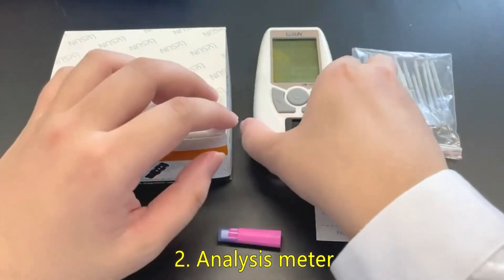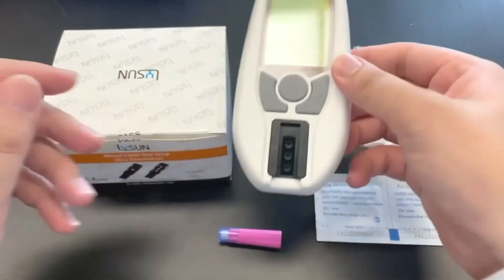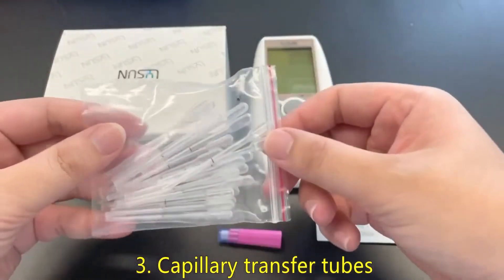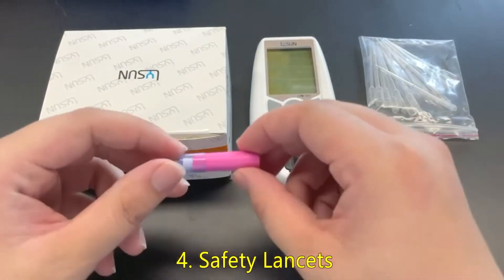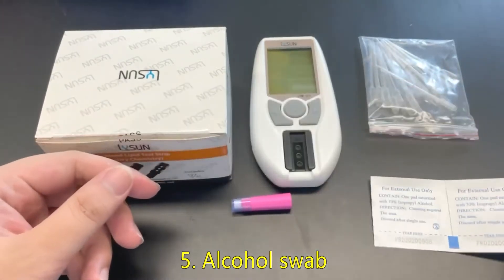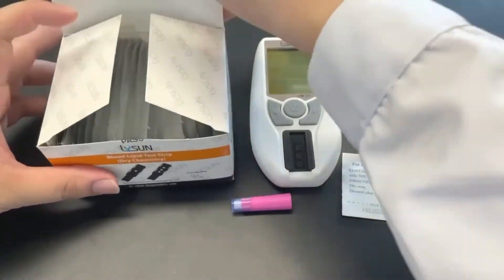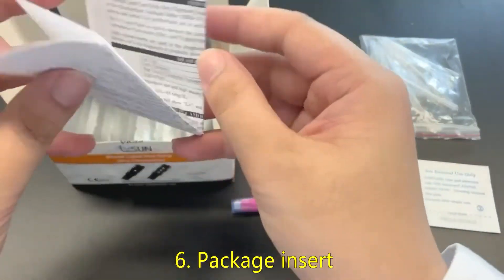Two, analysis meter. Three, capillary transfer tubes. Four, safety lancets. Five, alcohol swab.